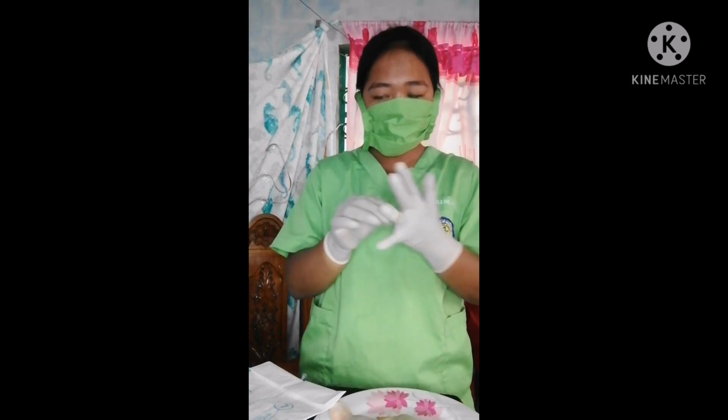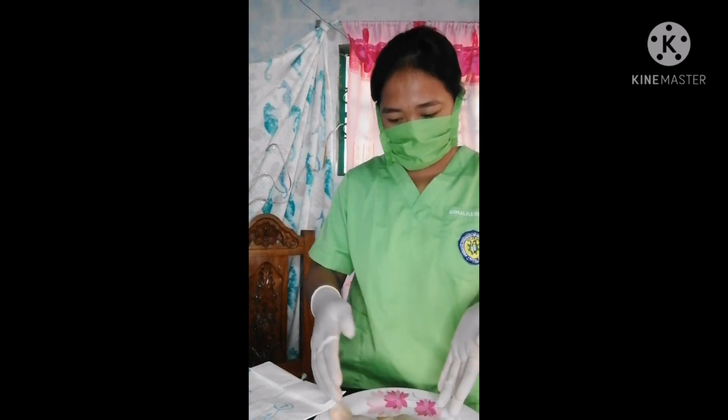And then next, select the appropriate administration site, and then assist the patient to the appropriate position for the site chosen and drape as needed to expose only the area to be used.